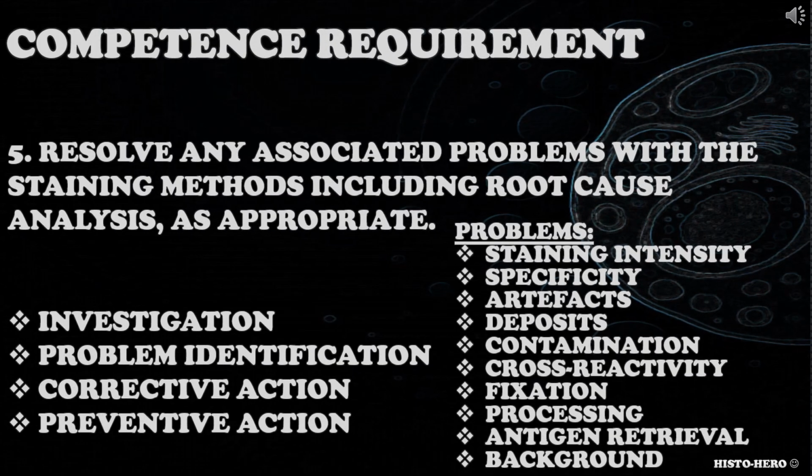The fifth competence requirement is for you to resolve any associated problems with the staining methods including root cause analysis, as appropriate. What are the common problems associated with relevant marker demonstration? How would you resolve them? How would you record them? Consider investigation, problem identification, corrective actions to fix the issue, preventive actions to minimize problems from reoccurring.